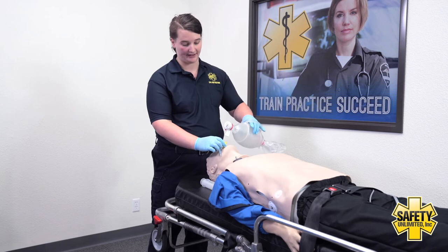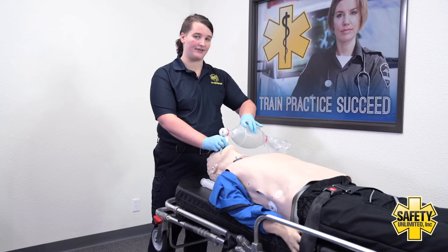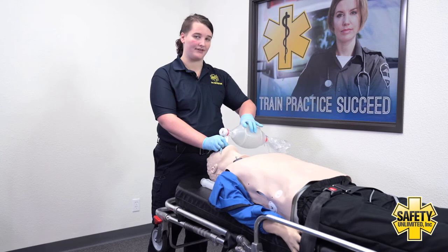Then I'm going to begin ventilating my patient. As I'm ventilating my patient, I'm going to be moving the tube back until I have equal chest rise and fall.